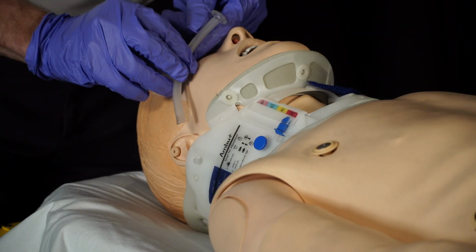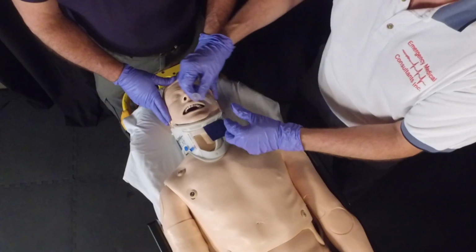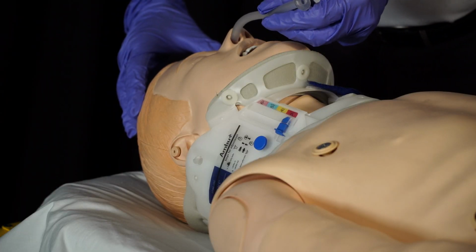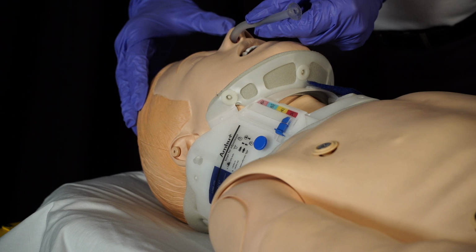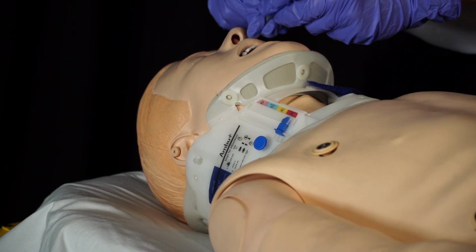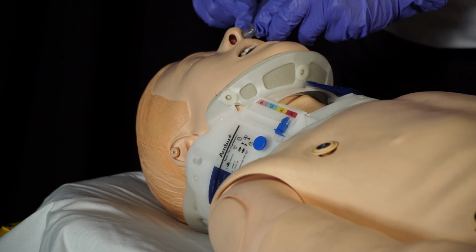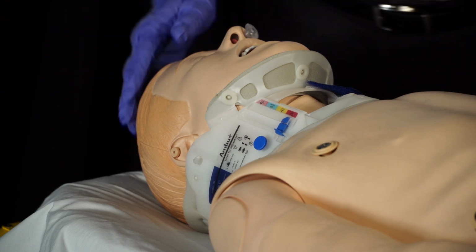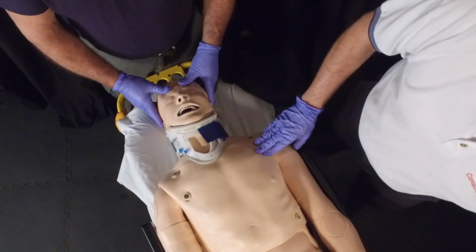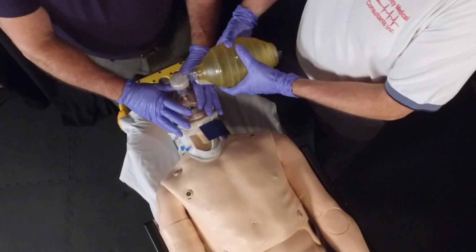So we measure this from the earlobe or the angle of the jaw to the tip of the nose. The bevel is designed to go towards the septum, so they're designed to go into the right naris. If for some reason you're unable to pass it in the right naris and you have to put it in the left naris, remember that you have to turn the device backwards so that the bevel is towards the septum, and then when you reach the back of the throat, or the posterior pharynx, rotate it around so that it goes down the back of the throat. So now this is keeping the tongue out of the posterior pharynx, and we can ventilate, if need be, as we were.